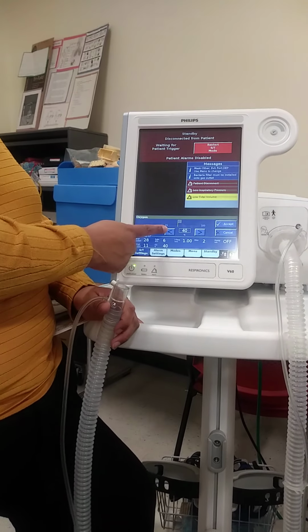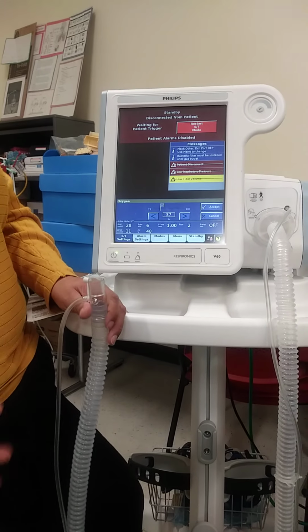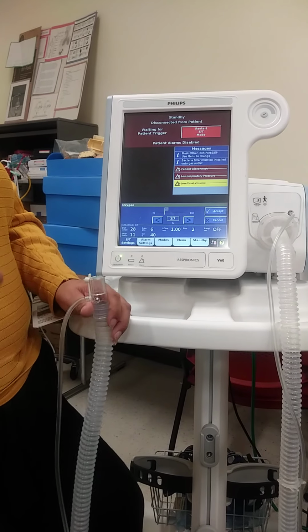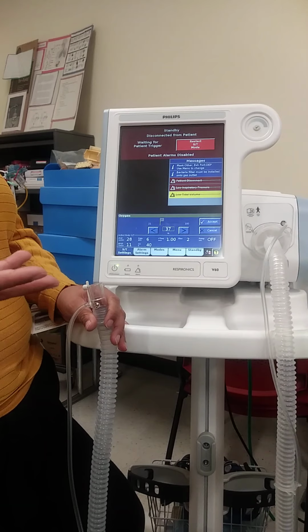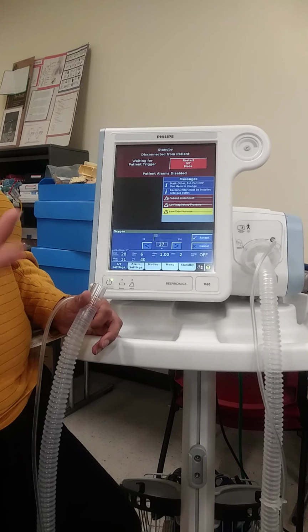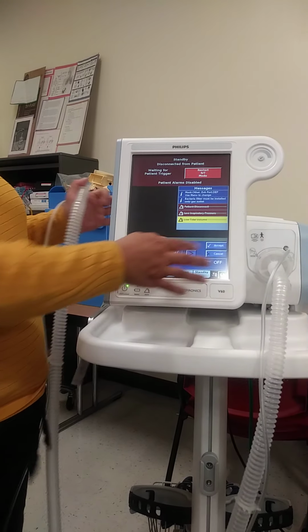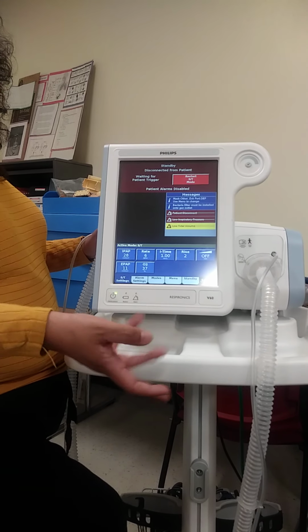Okay? This is your oxygen percentage, right? We all are breathing 21% oxygen, but we can go as high as 100%. So you would change that to maintain a good SpO2. If my patient's SpO2 is 88% on 40% FiO2, then you're like, oh, let me go up to 45 or 50 to normalize it to their 94 or 95. So you use this to maintain a normal SpO2 for your patient.